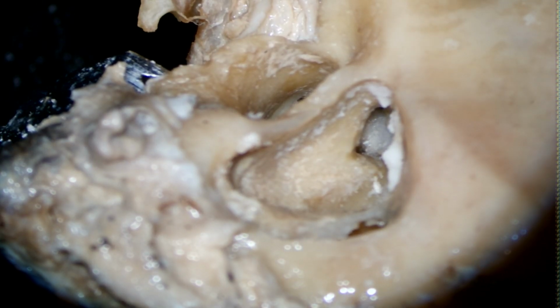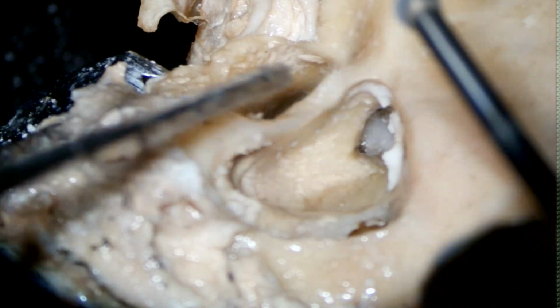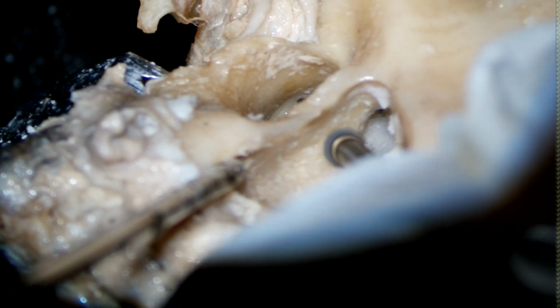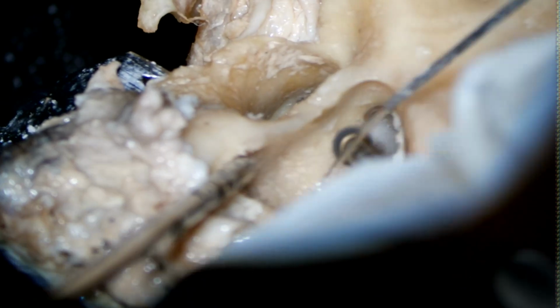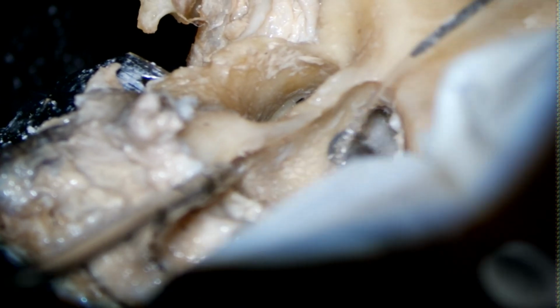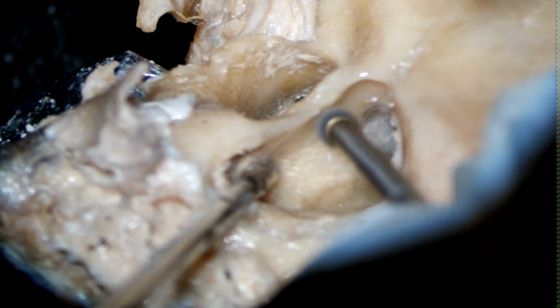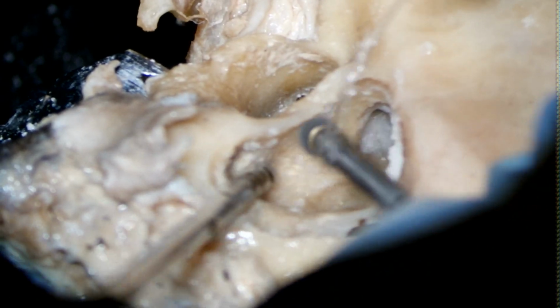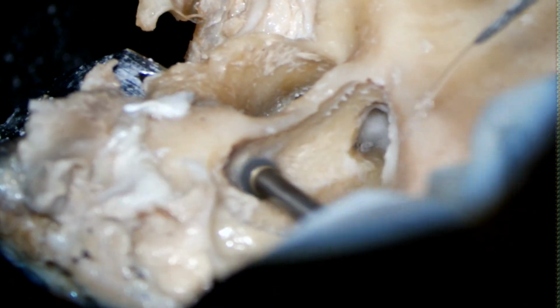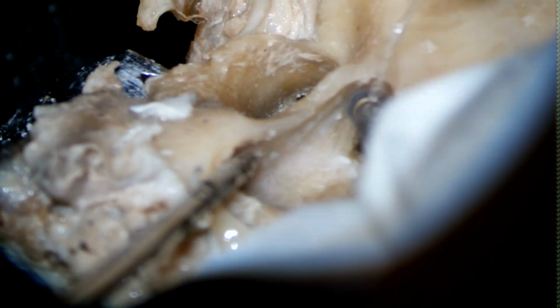So generally when you are drilling for posterior tympanotomy, there can be some cell which will point towards the posterior tympanotomy, and this is called the Herald cell. But I don't know whether we will be able to find a Herald cell here because it's a contracted bone. And here you can use a diamond burr to delineate the facial nerve. Some people will delineate the vertical portion of the facial nerve, be sure that yes, we have identified it, and then do a posterior tympanotomy.